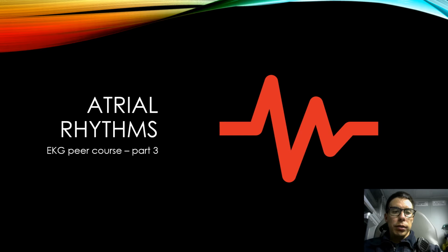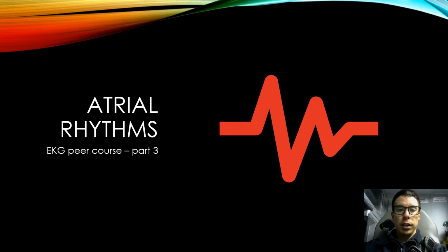In this video we're going to be talking about atrial rhythms, and just as I mentioned in the last video and how it will be in the rest of the videos, it's not going to be as complex, fortunately. Like I said, the first video is the hardest. Sinus rhythms were easier, and then atrial rhythms, for the most part, are actually even easier than sinus rhythms, at least in my opinion. So hopefully this one isn't too bad, and we'll try not to make it too long.